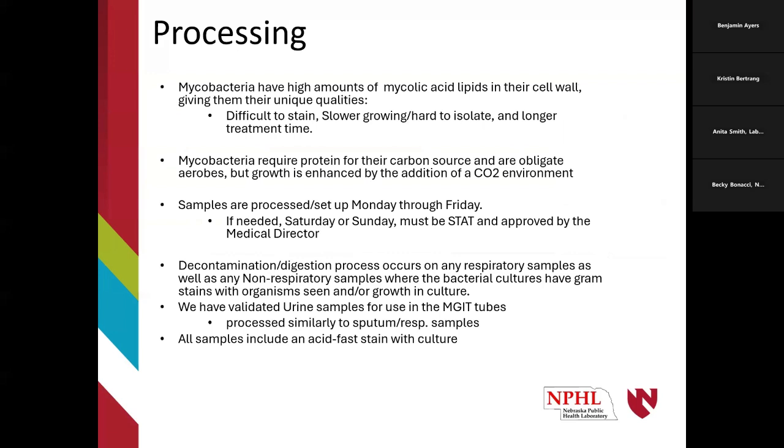The first thing that we're going to do once we receive the specimen into the lab is the processing. We have a cutoff time of about 8 o'clock in the morning, so it needs to get into the microbiology lab by that time. Otherwise, it will be pushed off to the next working day.